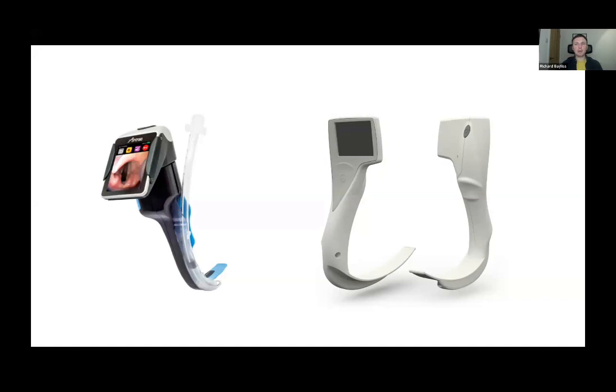Both of these disposable options have really low setup costs, because the cost of individual devices is quite low. But obviously, if you're going to start using them frequently, then the cost is going to stack up pretty quickly.